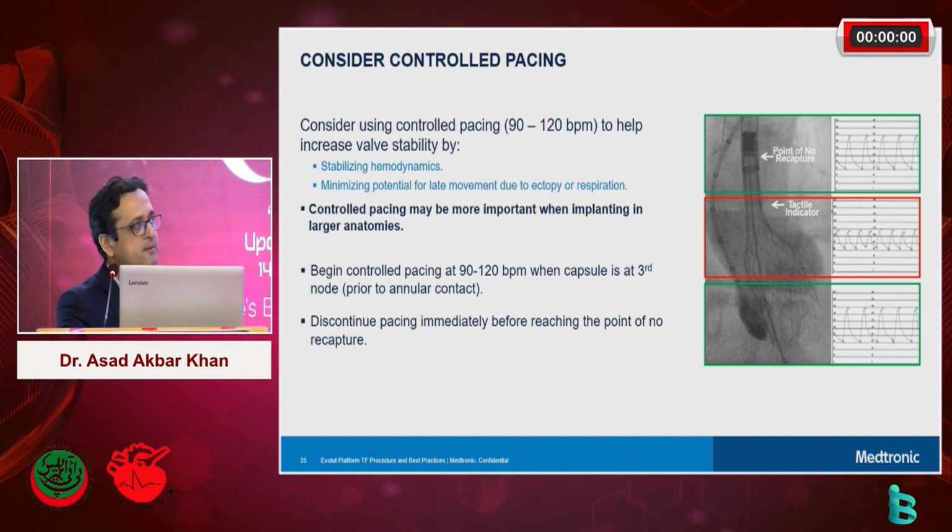and you hear a click sound in the middle of the deployment. The end of that point of no return is actually not determined by the tactile indicator, but by the gap between this dark part and this lower part of the delivery system.